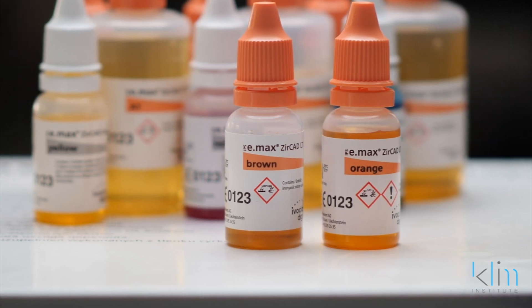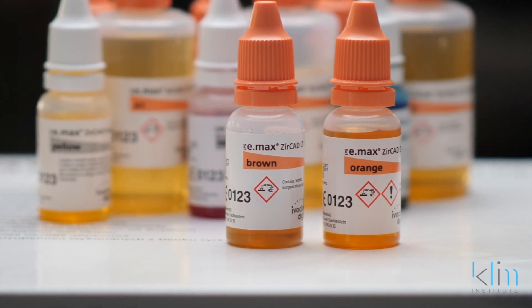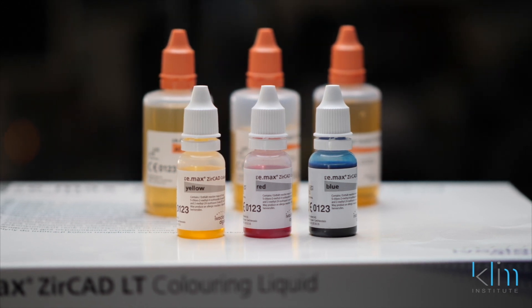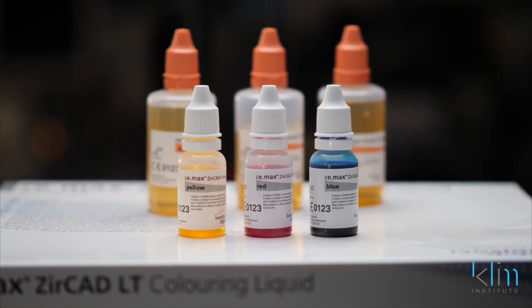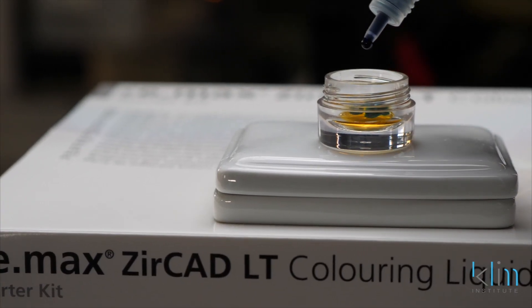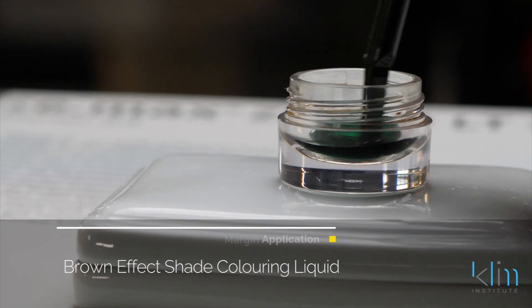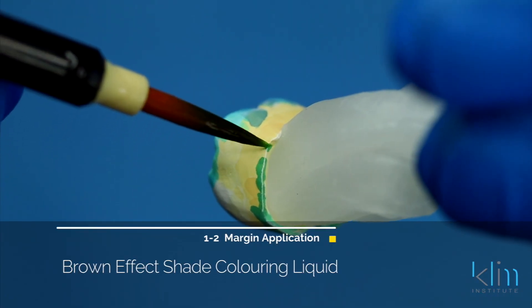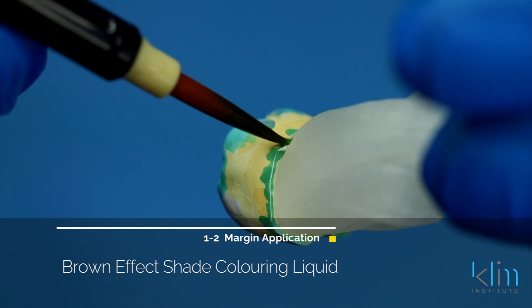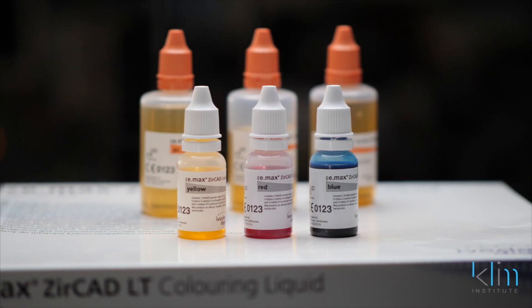We also have brown and orange. With the kit, we have what we call coloring indicators — these are dyes. Why do we use dyes? We're going to put the dyes into the coloring liquid so we can visualize the coloring liquid as we place it on our zirconia. The natural color of the liquids don't really have a lot of intense colors to them, therefore we use dyes. These are called coloring indicating liquids.